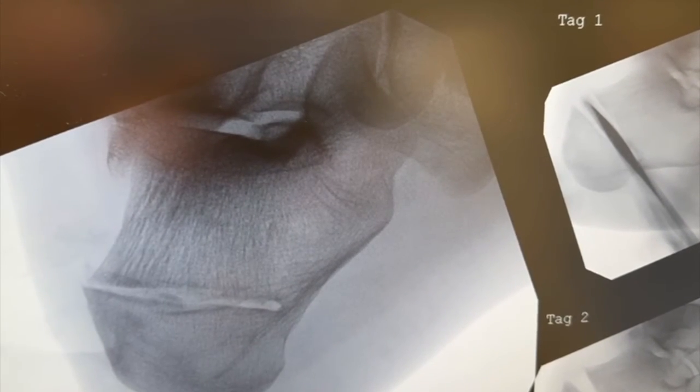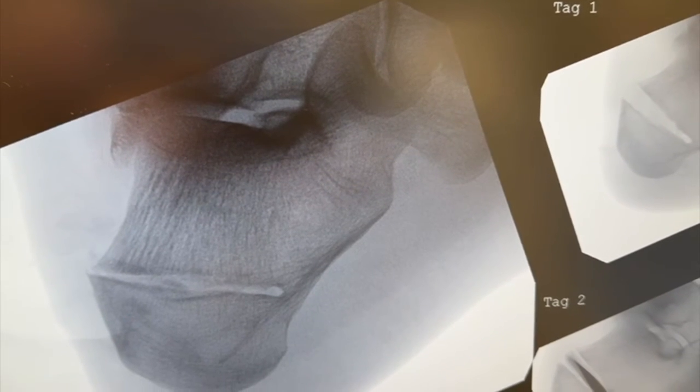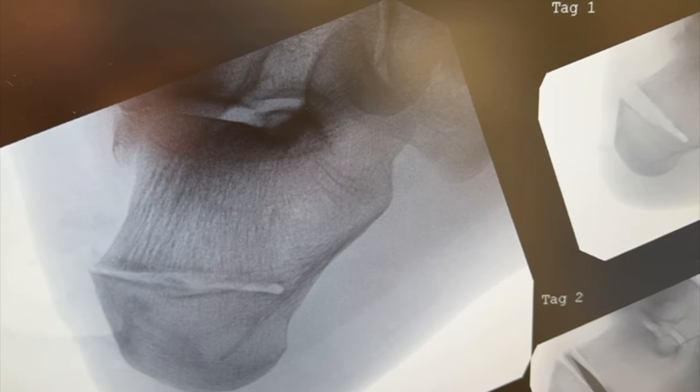You can see my assistant has now closed down the osteotomy. We're going to throw two 7 millimeter cannulated headless screws across the osteotomy for fixation, and we're finished.